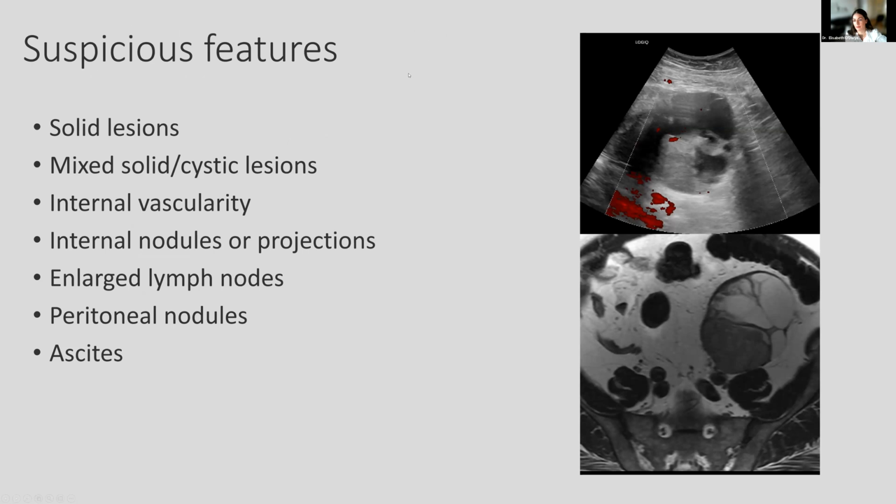And I hope that for some of the audience, you can appreciate that although it is a complex thing, this ultrasound also gives us pretty good information, and the MRI wasn't hugely additive in this setting. So just to reassure you that if you're not offered an MRI, that isn't always a bad thing.